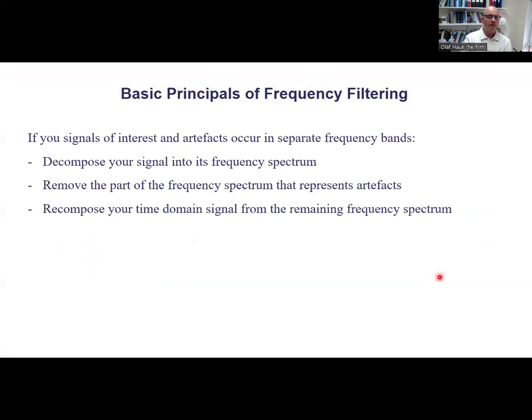That is basically explained here. So I had one session before where I talked a little bit about decomposition of signals in general. The idea is always to decompose your signal into components that are meaningful to you and that allow you to possibly decide which components are good, which ones are bad.